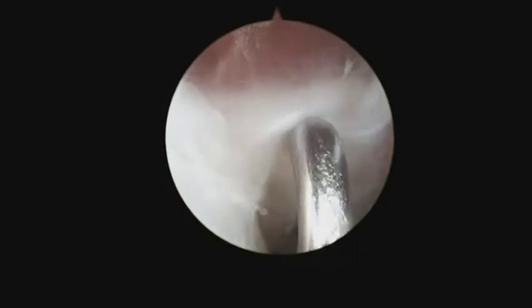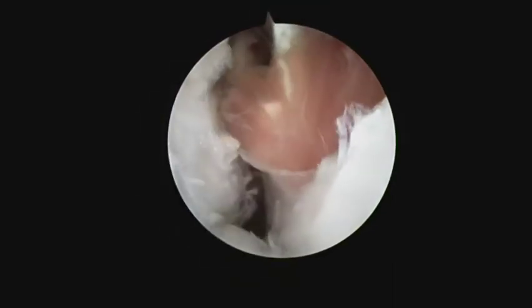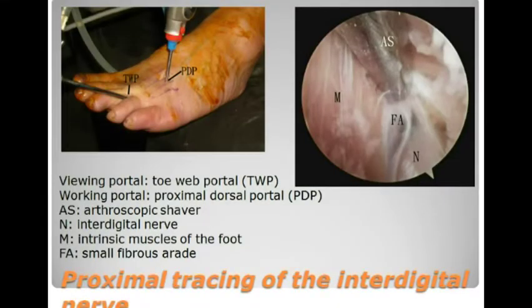Intermetatarsal ligament release is performed through the toe web portals with a retrograde knife. The proximal plantar portal is the viewing portal. The next step is proximal dissection of the interdigital nerve.